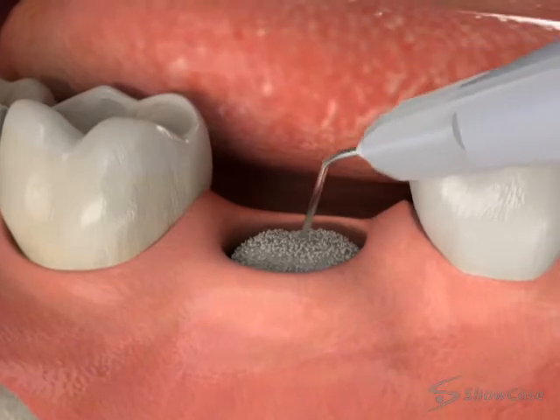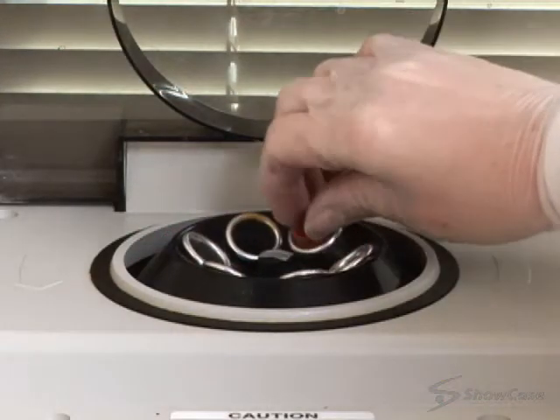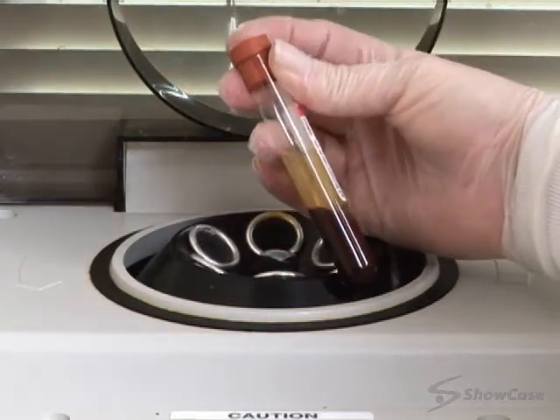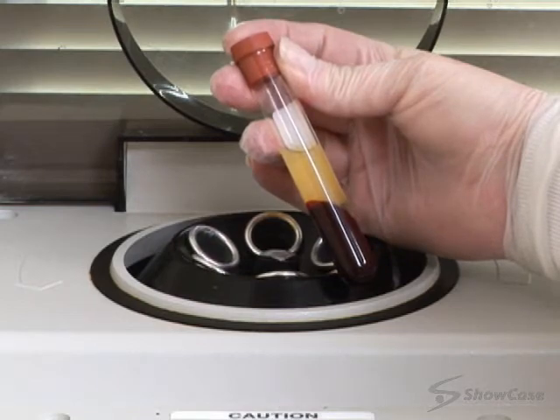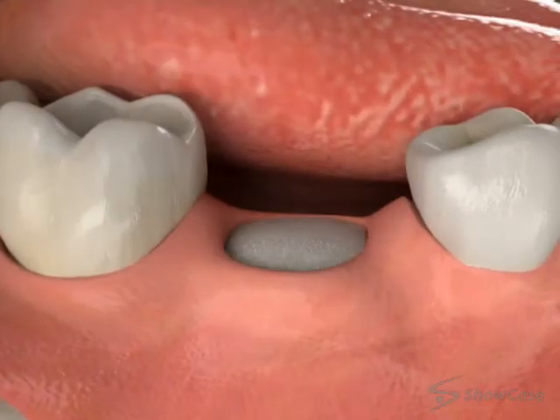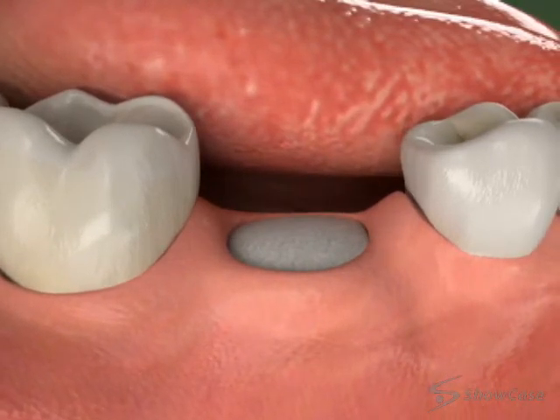Depending on the situation, we may also apply platelet-rich plasma to the site. This material, made from a small sample of your own blood, enhances bone growth and speeds healing. We may also place a special membrane over the graft to prevent unwanted tissue from growing into the graft site.